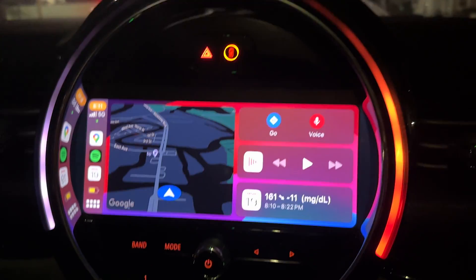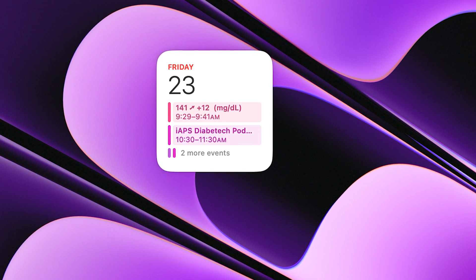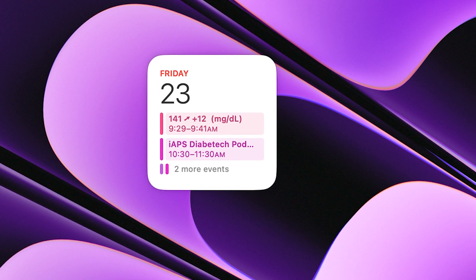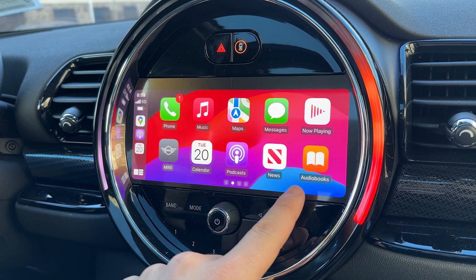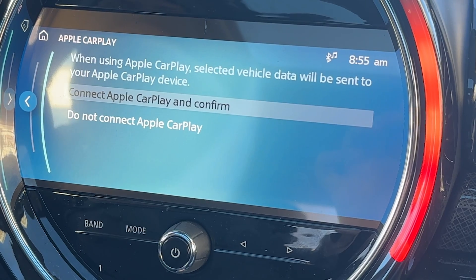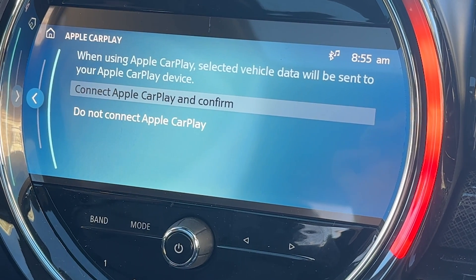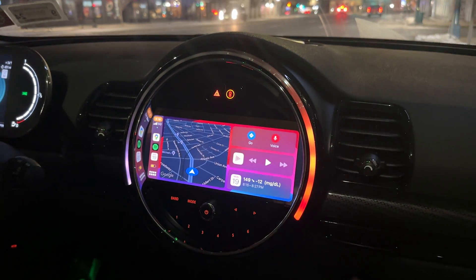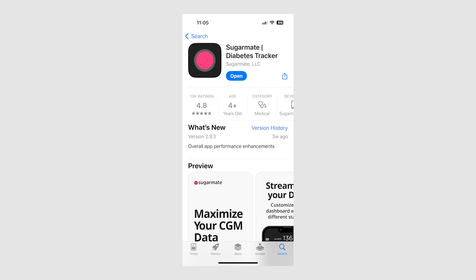What we're going to be taking advantage of is Apple CarPlay in the car and Apple Calendar — Apple iCal — in order to bring your glucose readings into the car. Sorry Android fans, this is an Apple-exclusive hack and I don't have a way yet for Android users to get their glucose readings in the car. The first thing you're going to need to do is download an app on your phone called Sugarmate.